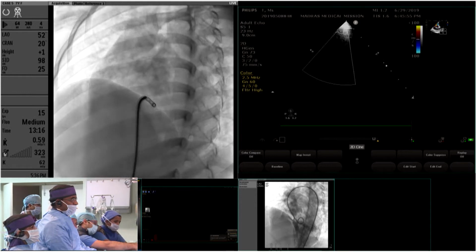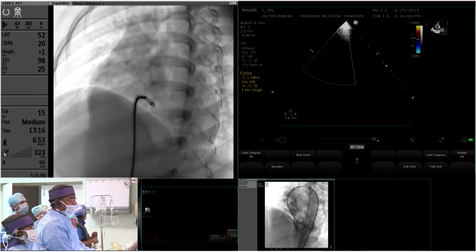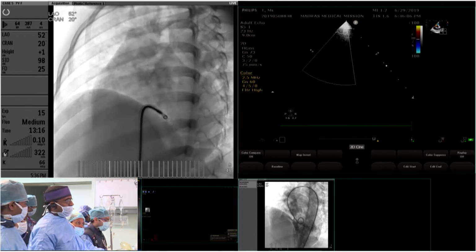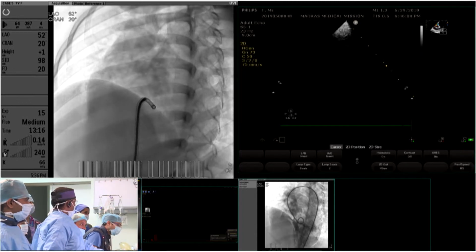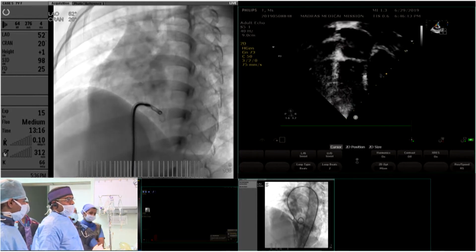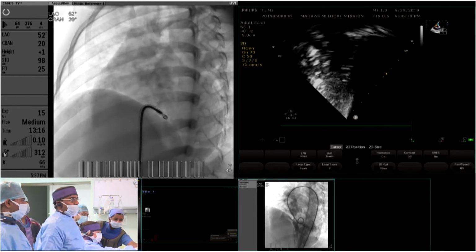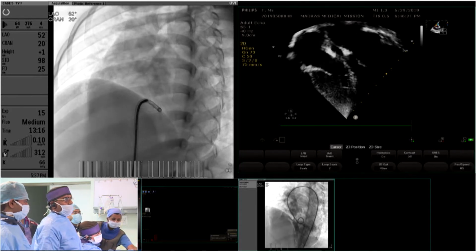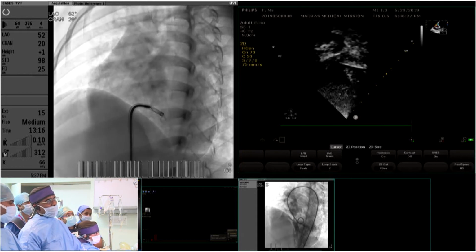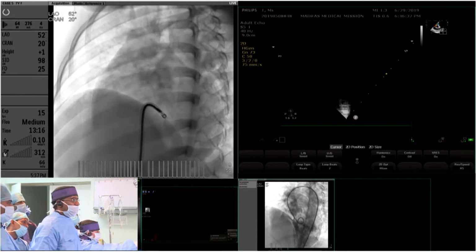It looked like Dr. Srija was telling it is in some card. Oh no, it is not. Can you show me the echocardiogram where we are? Apical four chamber. I want a proper picture. You take over. Shiva, were you not able to pull it back so easily? I just wanted to see where it is lying. That's the device in the LV. Okay, maybe take your hands out.